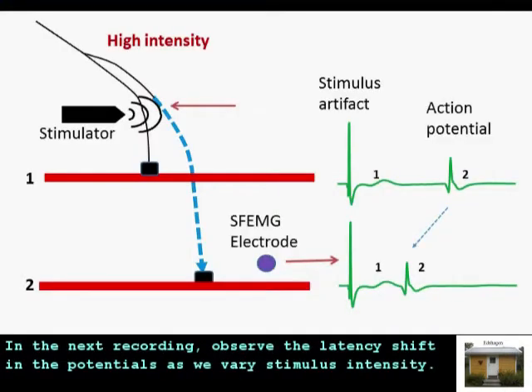In the next recording, observe the latency shift in the potentials as we vary stimulus intensity.